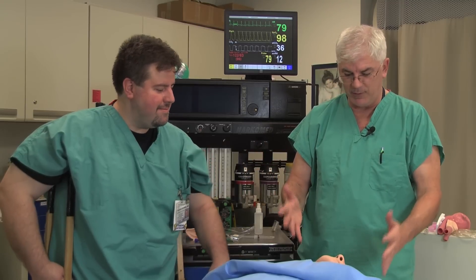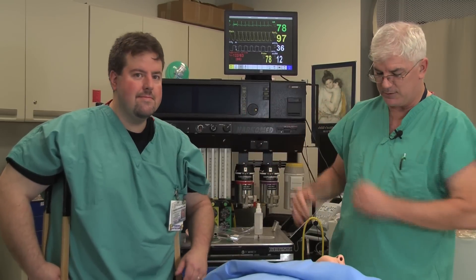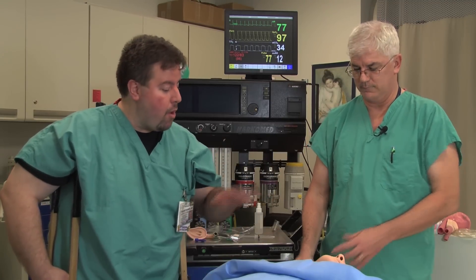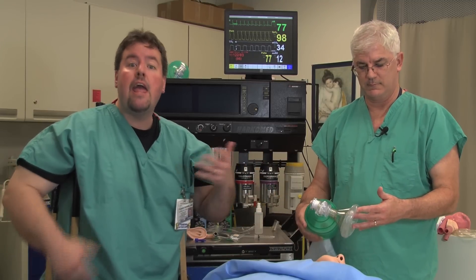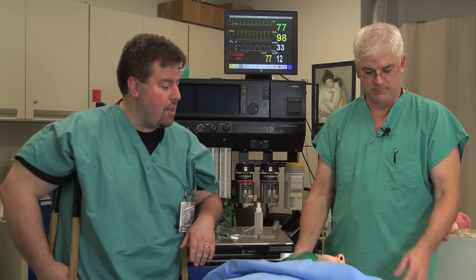What kind of stuff do you want to have ready when you're about to intubate someone? We'll go to Dr. Corrado for that. So we're going to intubate a patient. Since this is preparation, we want to make sure we have everything ready to go, everything that we'll need to secure this person's airway. We're going to want something to give mask ventilation. In this case, we have an ambu bag — something that we're able to oxygenate and ventilate the patient with.